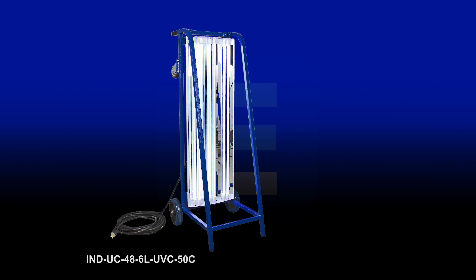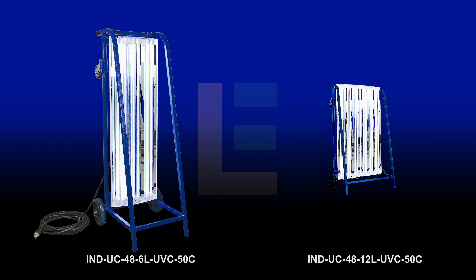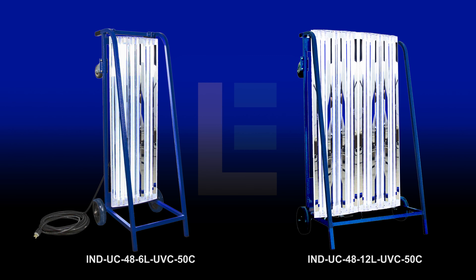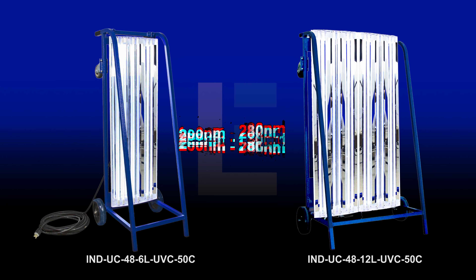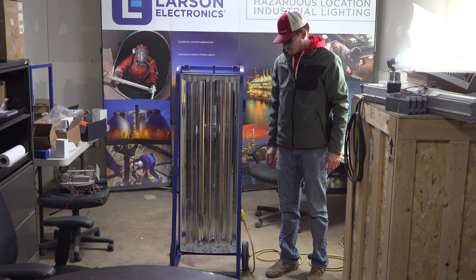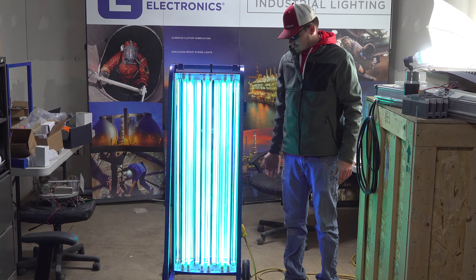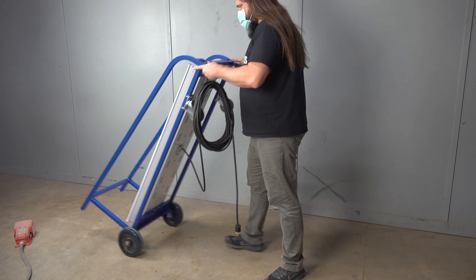Our IND-UC48-6L-UVC-50C UV Sanitation Cart and IND-UC48-12L-UVC-50C High Powered UVC Sanitation Cart are industrial strength and can kill up to 99% of viruses in large facilities using an output range of 200 nm to 280 nm of germicidal UV light. These UVC Sanitation Carts feature a recommended 20-25 minute exposure time for viruses and other contaminants, making them highly efficient and effective.